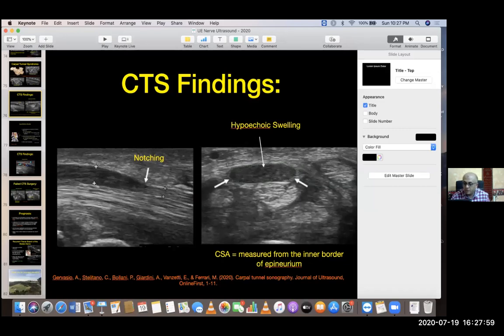Usually, I would suggest there's a procedure right now. They call it the Sonex procedure, where they do an ultrasound guided release of the flexor retinaculum. There is a distance that they measure from the middle finger: they put a line at the midline of the middle finger and move it towards the ulnar side just to avoid the thenar motor branch.